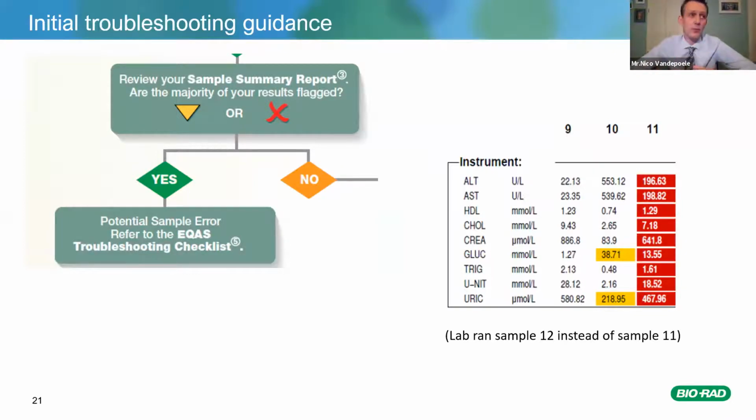This could also be something due to reconstitution of the sample. I've heard examples where people, by mistake, took the wrong liquid and put some alcohol, for example, in the sample. Well, your sample will be degraded and you will not be able to run the sample anymore. People reconstituted with tap water. That could also affect some of them.